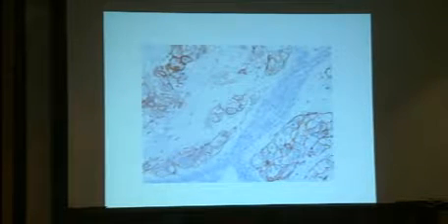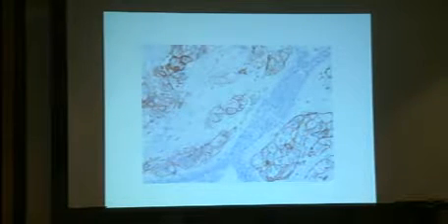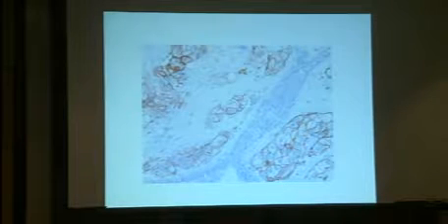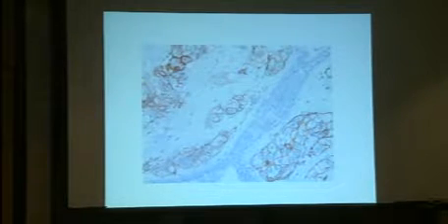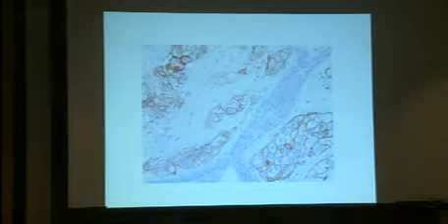This is also seen at a higher magnification. You can see the difference between what we have on the top, very strong staining 3+, and lighter staining 2+. This is a 2+ in my lab. In other labs, this could be 3+, but in my lab, when the staining is this type, it's 2+, and the 3+ are really darker. So it's a 2+ case, it's not a 3+ case, so we decided to do FISH. We did FISH too, but I will show you two aspects.